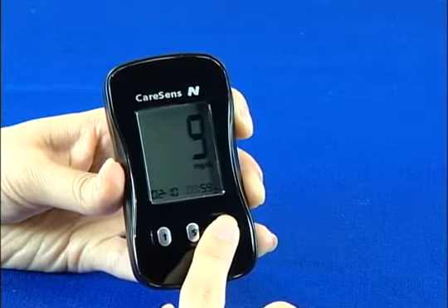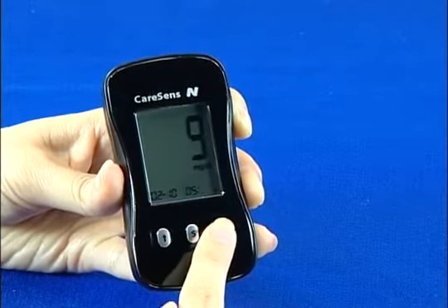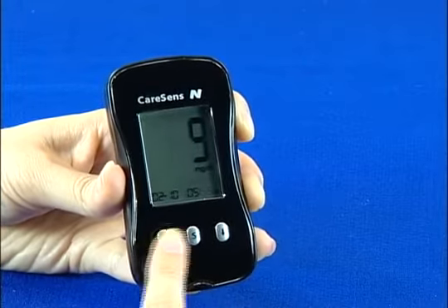Adjust the time using the arrow buttons. Press the S button again to set the minute in the same way. When you are finished setting the time, press the S button to set the unit of measurement.